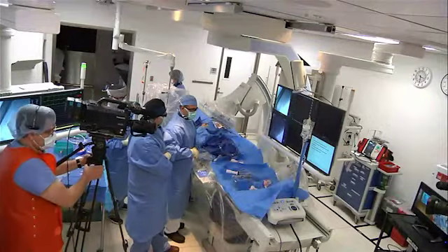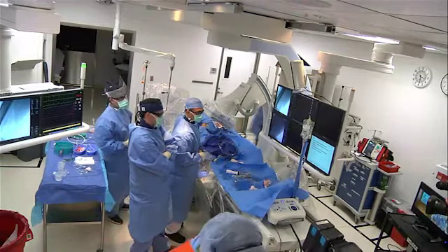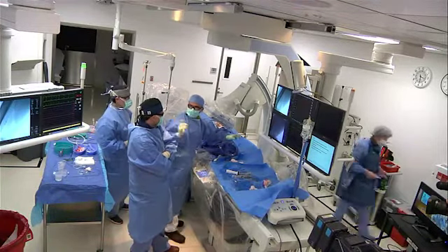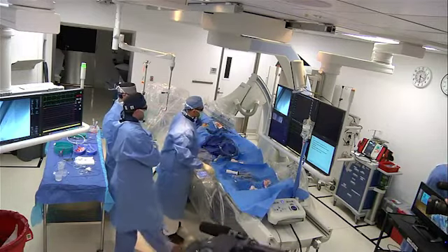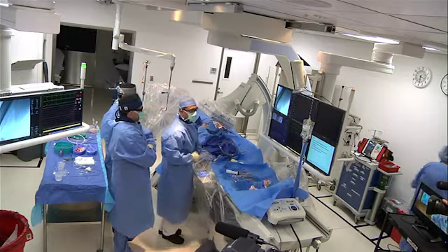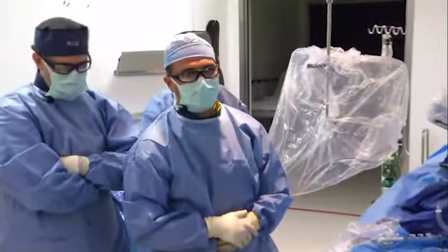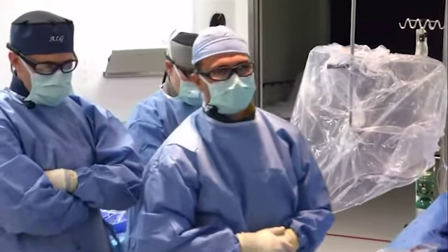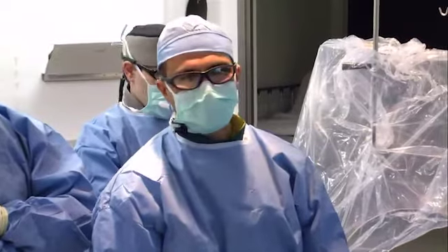Great job, Andy. And we are having a little bit of challenges. Obviously, that's the beauty of live cases. So if you can show this monitor, please, let me show you. We've been trying to get the sheath up there, and there are not a lot of pictures. But basically, we are having a little bit of trouble passing the sheath. As you know, his groins have been operated on multiple times. So he has extensive groin surgery in the past. And also, he has had a prior stent in the iliac.